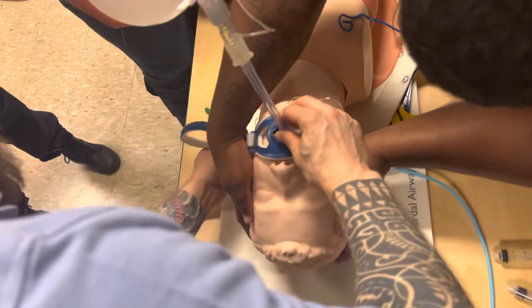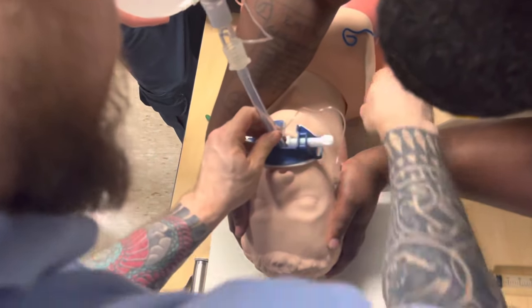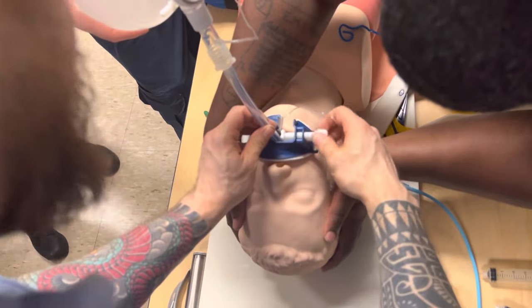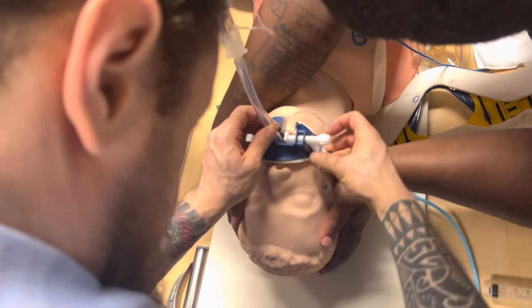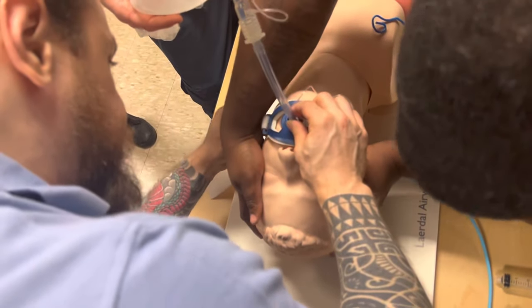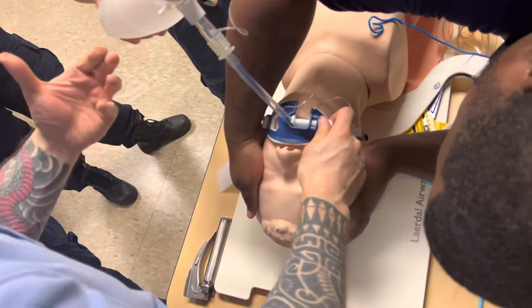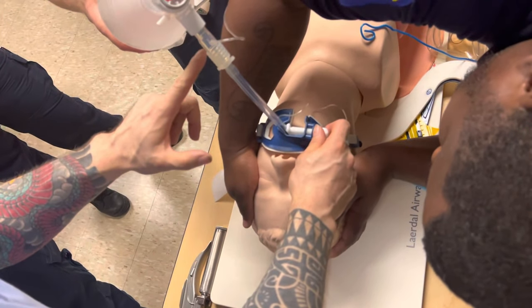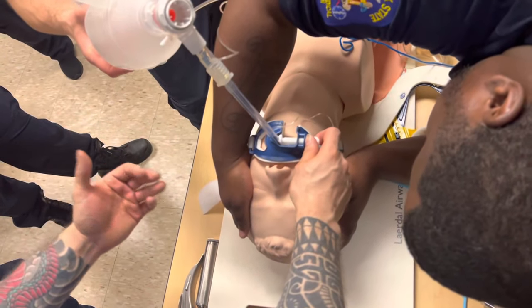We're going to put this behind his neck. Don't do the bolt first - we want to get the Velcro going. Because if I do the bolt and then adjust the Velcro, I'm going to have problems and may pull it left or right. So the Velcro is the first thing to be secured - that goes behind the neck. Once I secure it, I verify my lung sounds, I verify my end-tidal CO2, I verify my pulse oximetry. Once all this is done, my tube is verified.